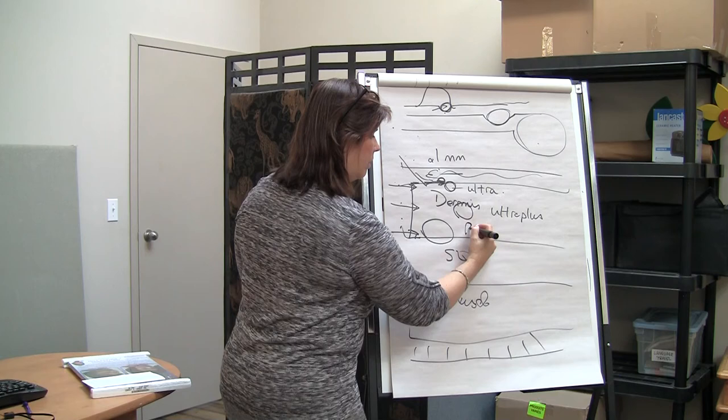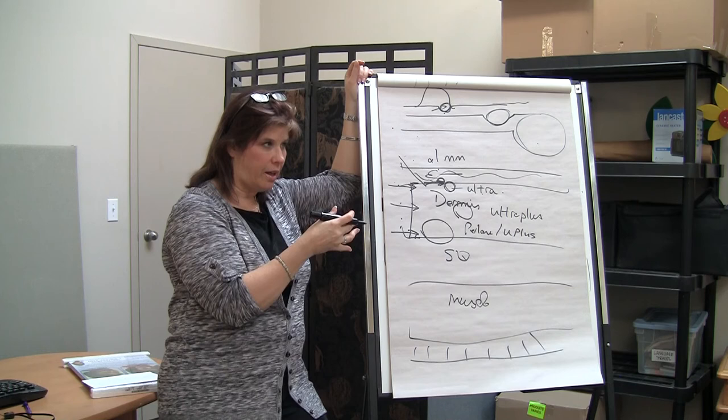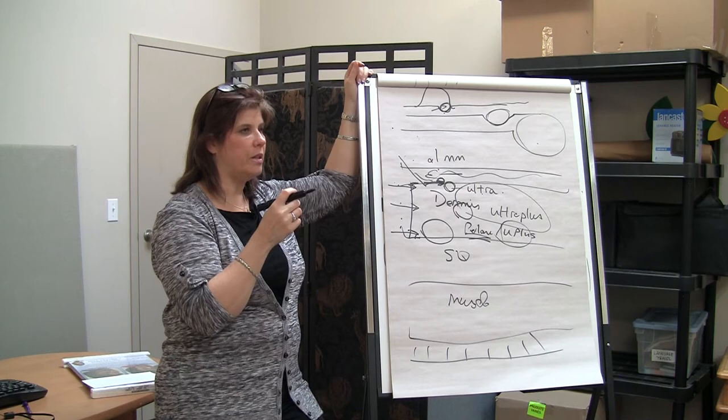So, just to be clear, these are my preferences. There are other companies that make really great filler. It's just that these are the ones that we've gotten used to, and I tend to use mostly these two and this one. And Perlane is for when I really have something big. And I'll show you the difference between a person who would use Perlane versus Ultra Plus.